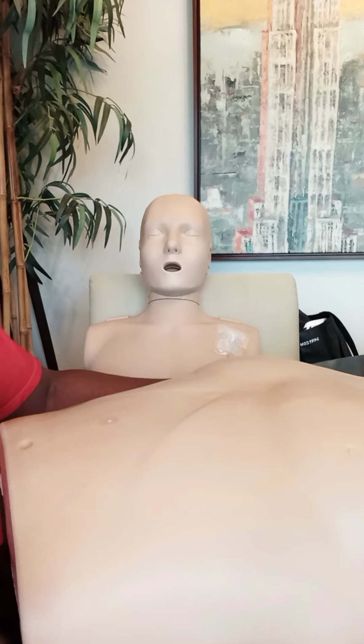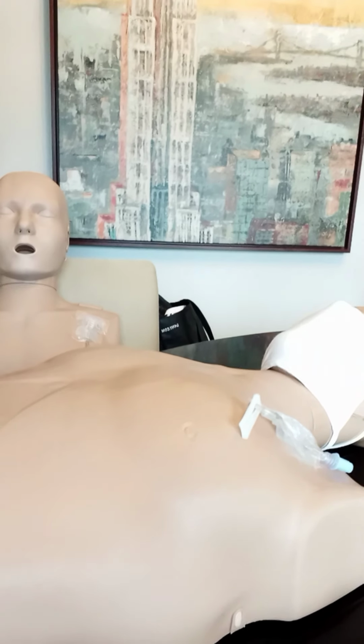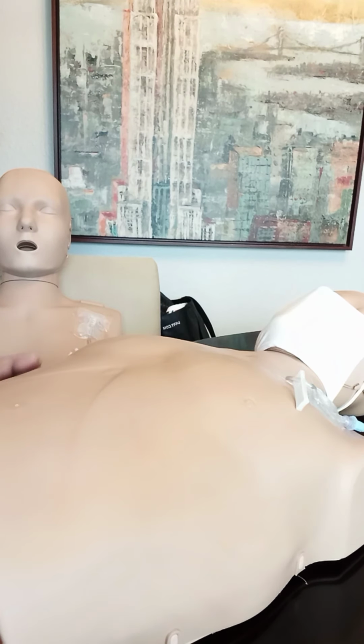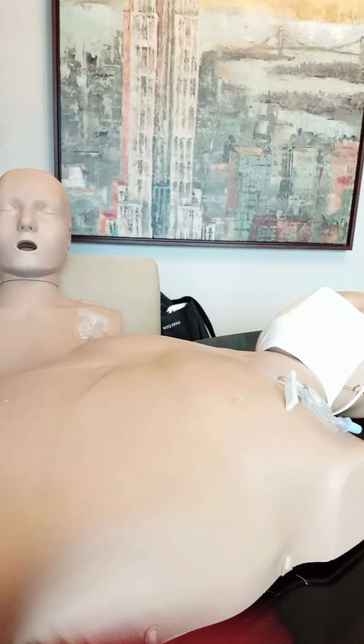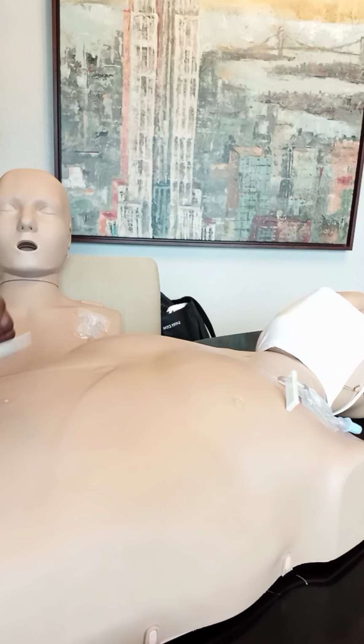So here we go again. Let me see if I can fix it where you guys can see. Okay, so this is the right side. This is the left side. The reason, again, for this, is you do not want to place these AED pads over those areas.